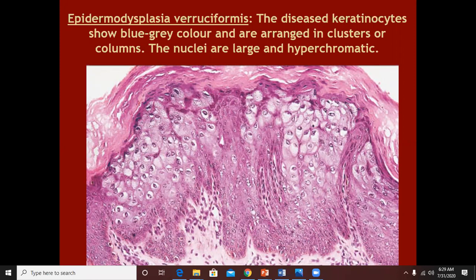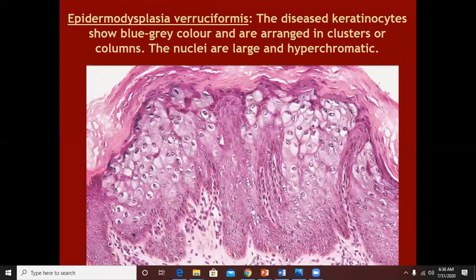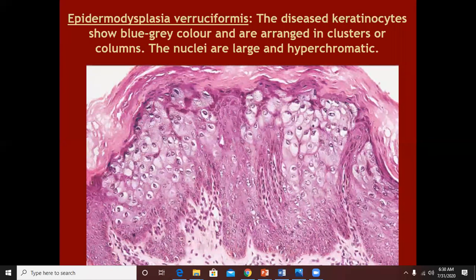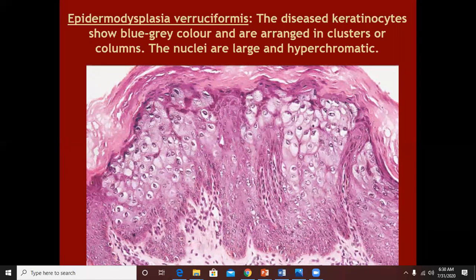To summarize warts, the features you would look for are: number one, hyperkeratosis; number two, papillomatosis; number three, acanthosis. All warts with a filiform surface will have papillomatosis. Thick hyperkeratosis will be seen in filiform warts, but just above the papillomatous surface there will be parakeratotic tiers.